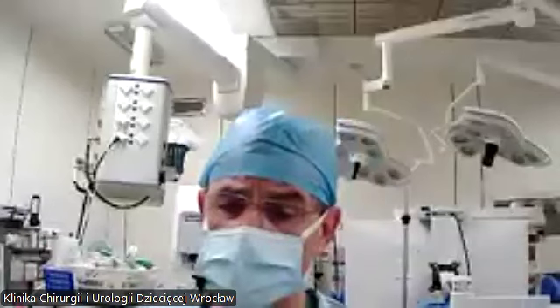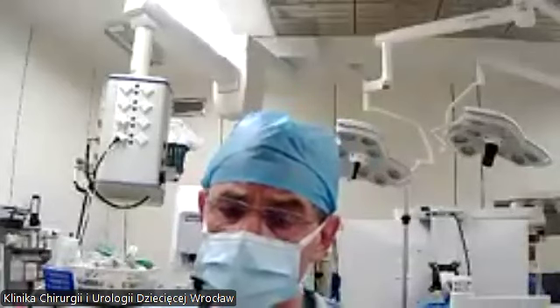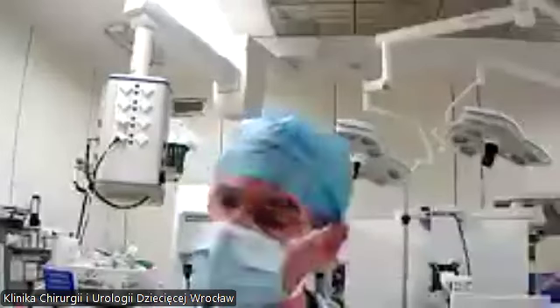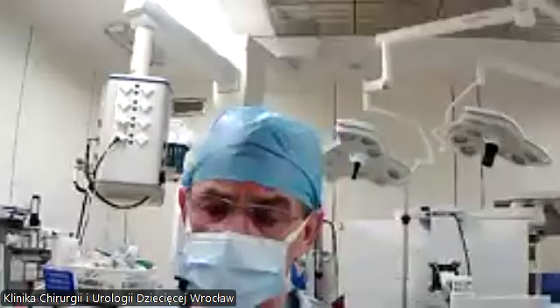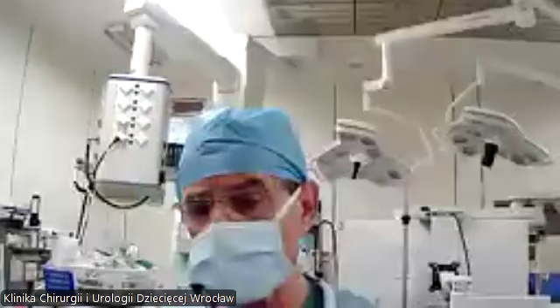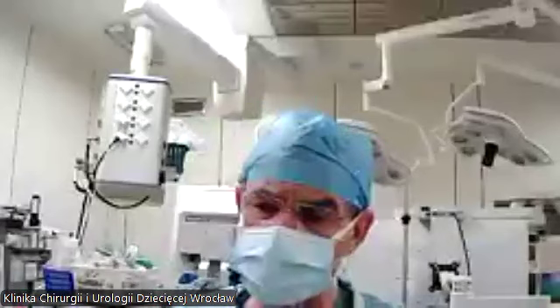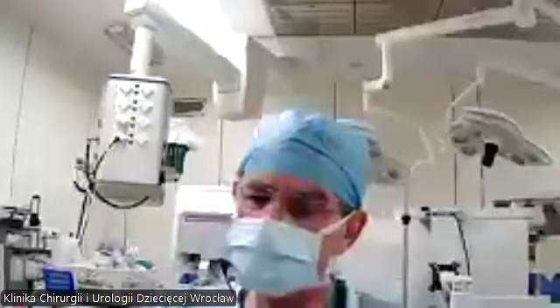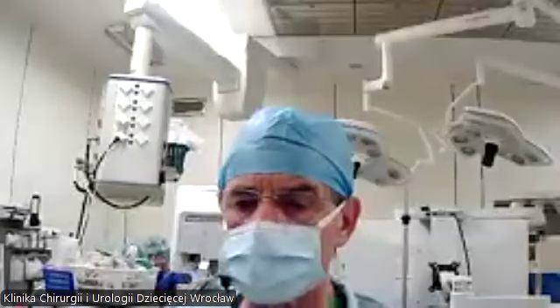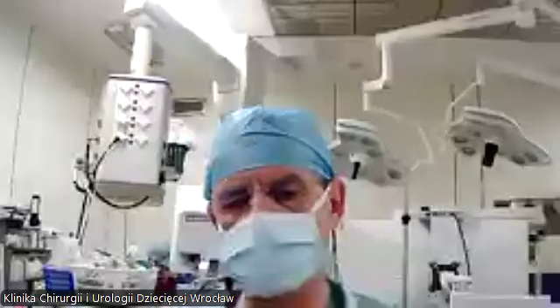This position usually gives you a fantastic view of the mediastinum, and also a good position of both working instruments, because they are almost at a 90-degree angle, so you can manipulate the needle and have a good direction of the needle. That's the most optimal for us. I know that some people place the scope just between the vertebra and the scapula, so you are watching from above. But I think that with that position of the trocar, the scope keeps the lung from entering our view. Usually with insufflation of 6 millimeters of mercury for a newborn, the lung completely collapses.